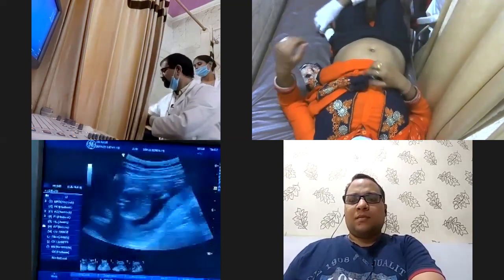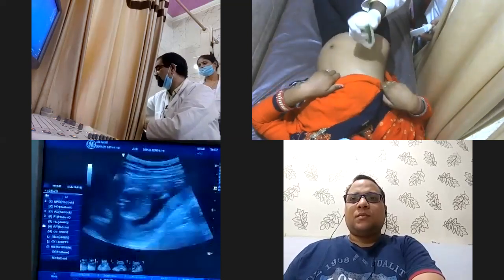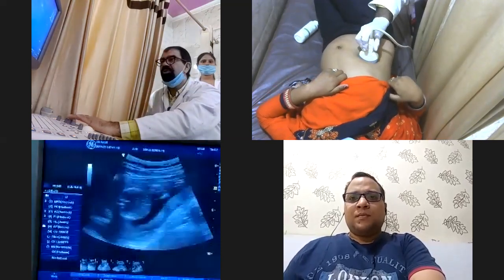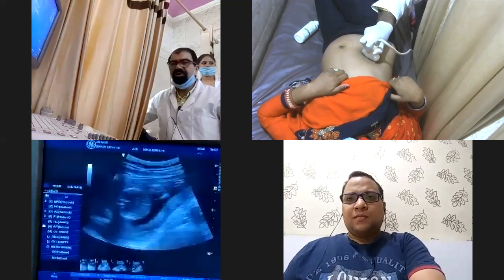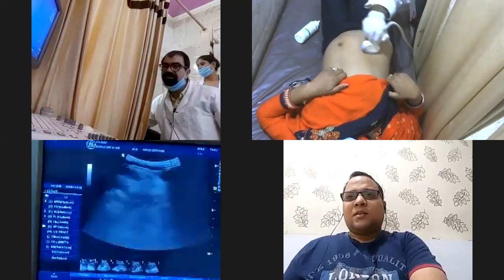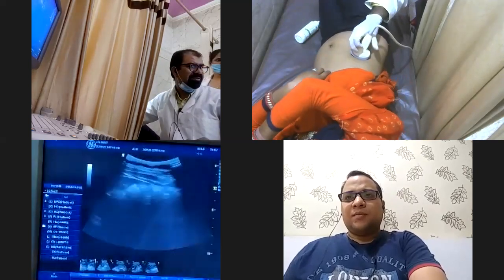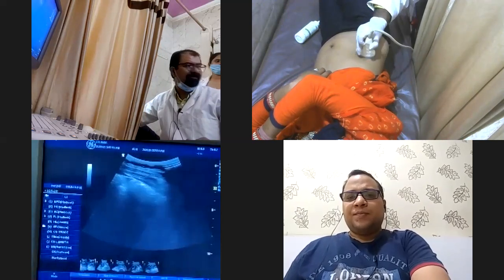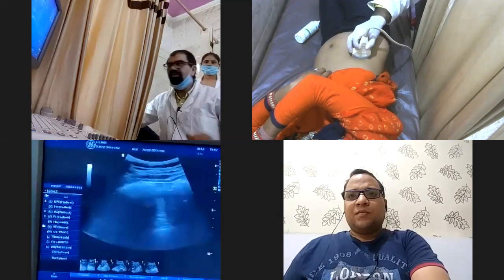करवट लो उधर, इधर करवट लो, उधर करवट लो, बस रुको. Now see the probe. Are you able to see the probe? Yes, sir. Is this right now a transverse or a longitudinal section of the patient? So this is transverse, sir. Yes, sir. This indicator will face towards the patient's right. It means that the indicator is over here, and whatever I am taking will be the transverse section, right? Yes, sir.